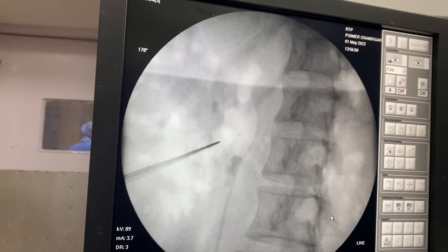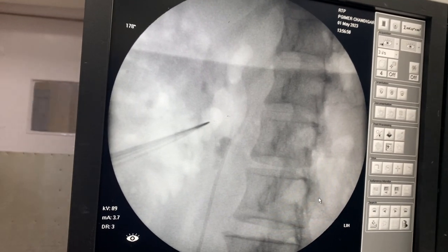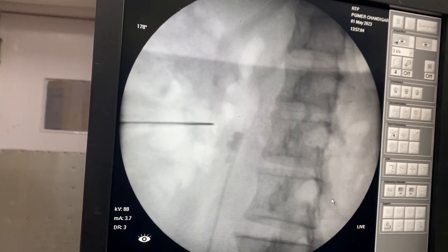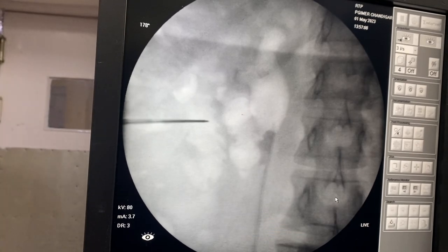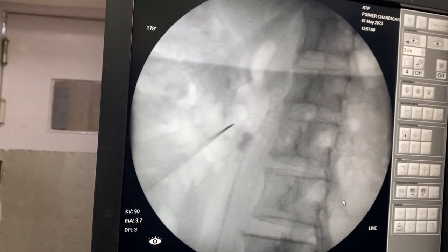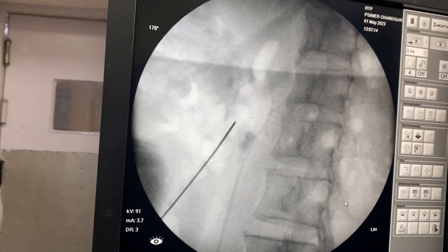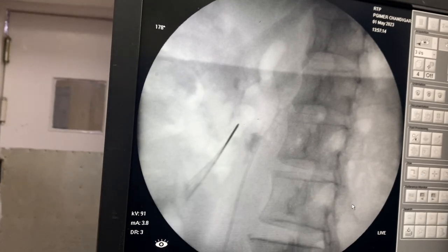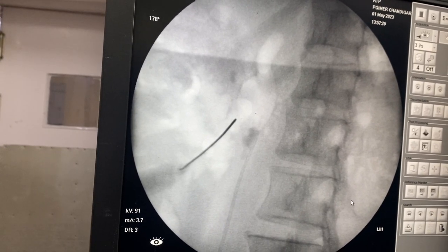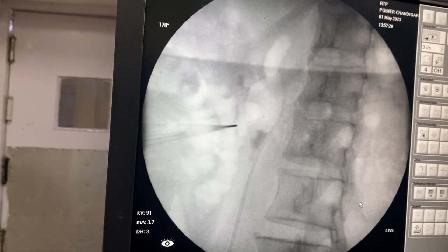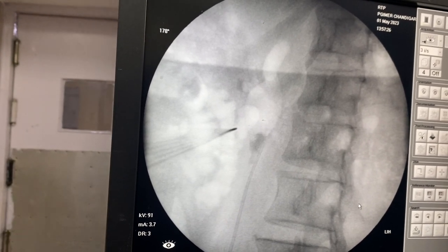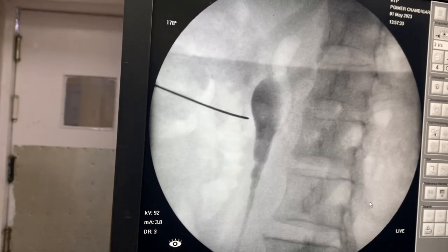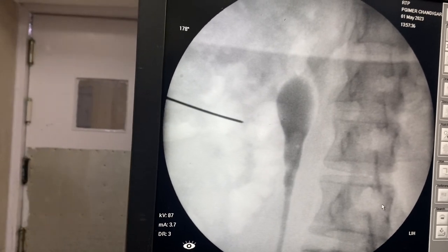That confirms the calyx we are pointing to is the posterior calyx. We conventionally always do a bullseye puncture — I am putting the needle there now. I am assessing the depth in 0 degrees, then aligning the needle at 30 degrees so that it comes into a bullseye location. I have asked my assistant to inject contrast again so that the target calyx can be seen clearly.